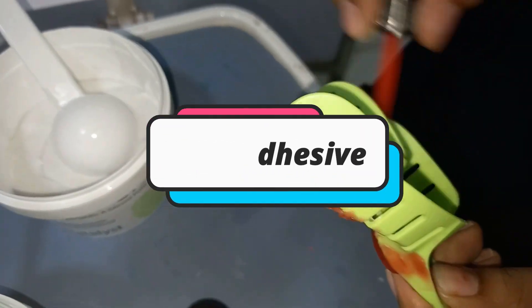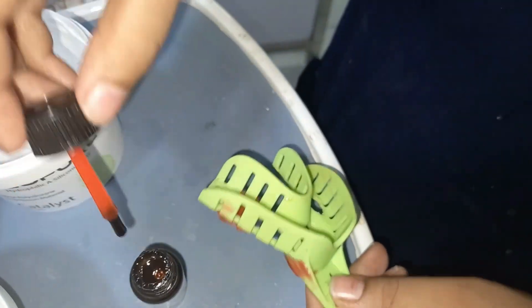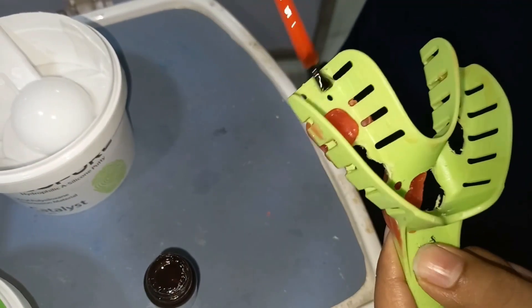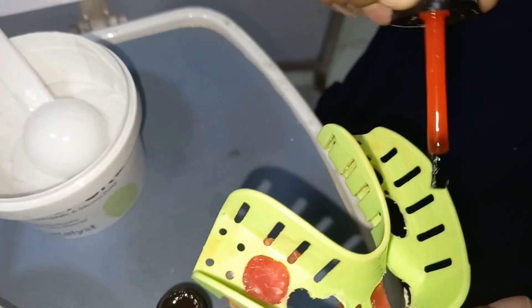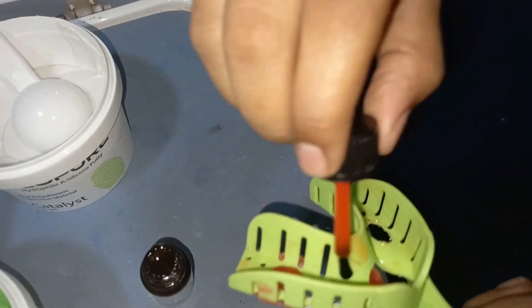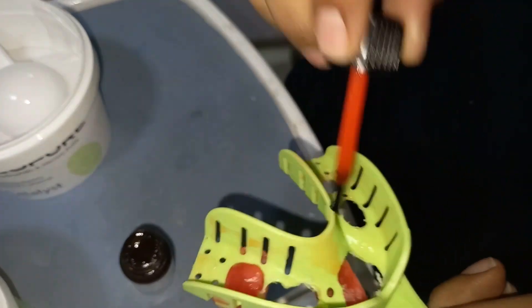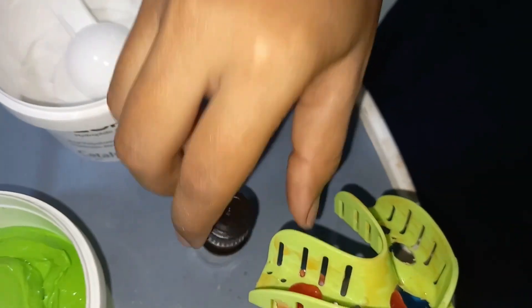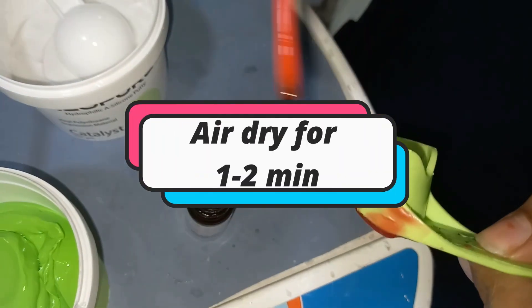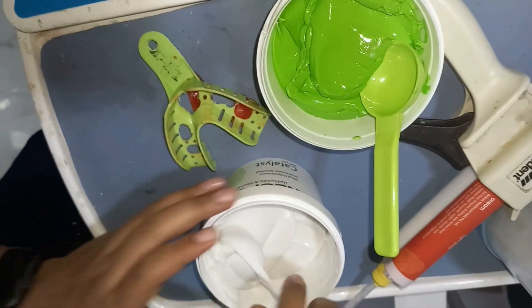Before taking an impression, we have to apply a tray adhesive to the impression tray because addition silicone does not adhere chemically with the impression tray. During removal of the impression from the mouth, a weak connection between the impression material and the tray leads to distortion. After applying the tray adhesive, you should wait for at least one to two minutes and air dry the tray adhesive before taking the impression.